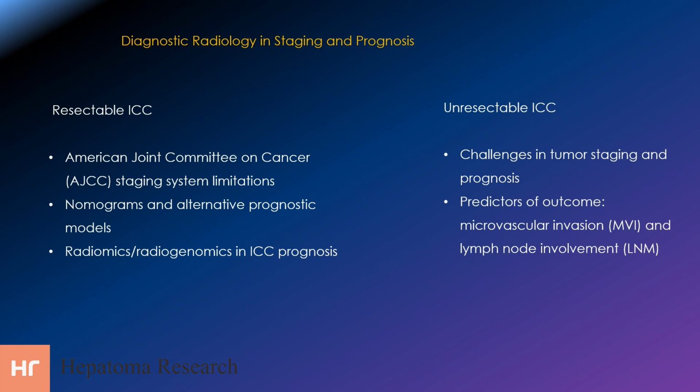PET-CT and PET-MRI have demonstrated advantages in detecting ICC, assessing metabolic activity, nodal staging, and identifying distant metastases. SUV max values obtained from PET have been associated with overall survival and recurrence. Novel ligands such as fibroblast activation protein inhibitor tagged to PET show potential for improved imaging and staging of ICC, but further research is needed to establish their role.